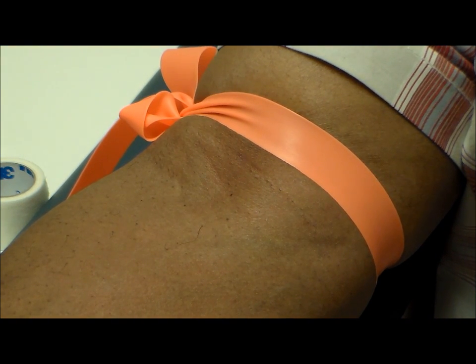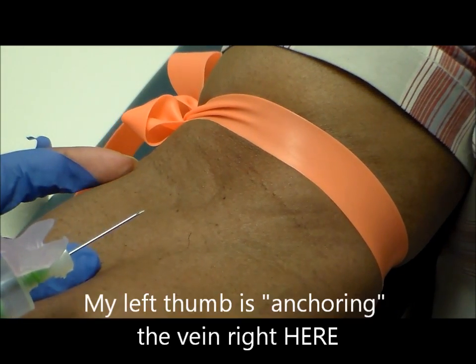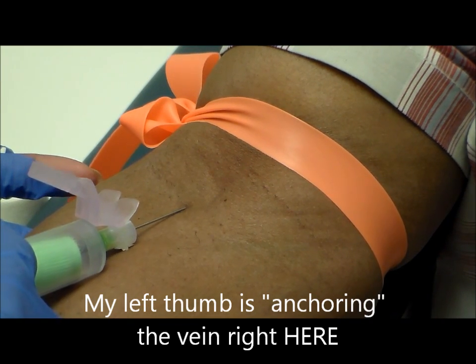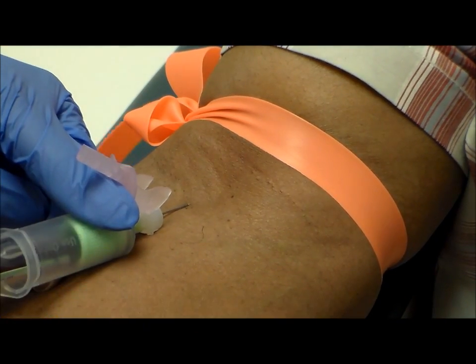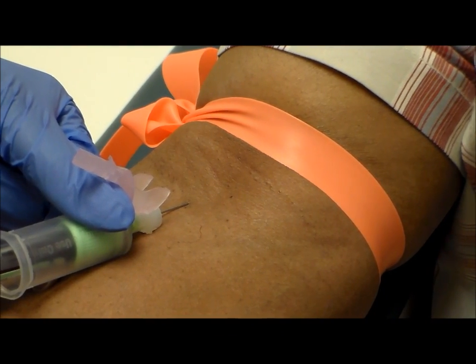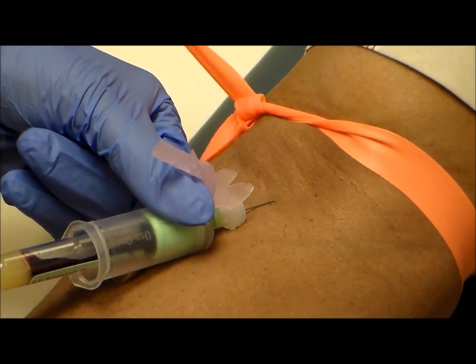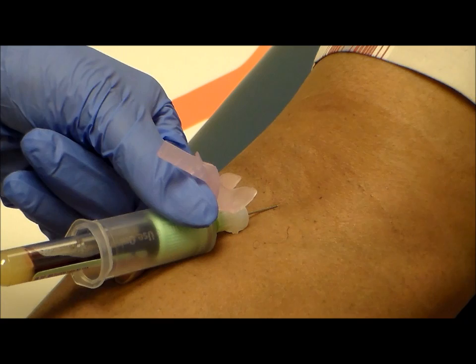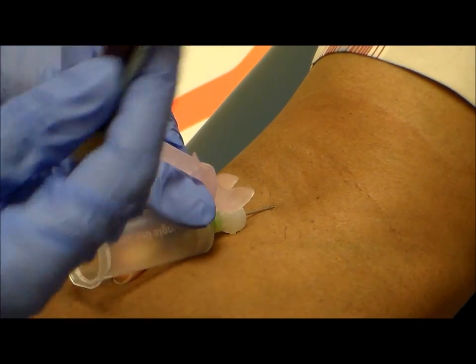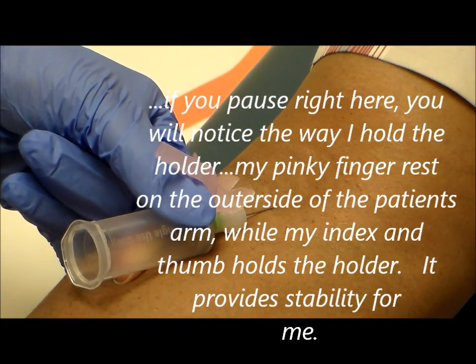I am using a 21 gauge, you guys know that is my favorite. And of course you can't see the vein, but of course we do not stick by sight — we stick by feel. I know exactly where my vein is because I have already prepped the site and I felt it. I use both hands; that is something you are going to learn and get comfortable with on your own. I never move my needle.